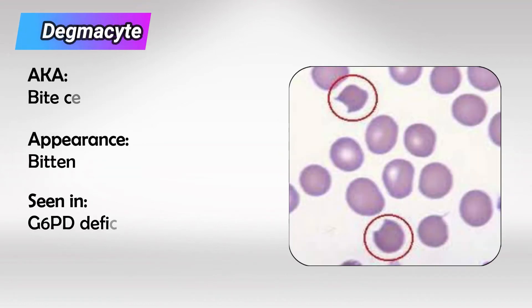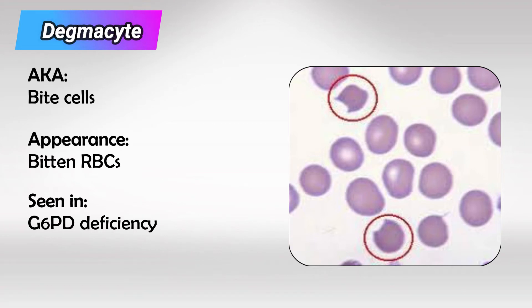Next we have degmacytes, which are commonly referred to as bite cells. These are highly characteristic of the disease G6PD deficiency.